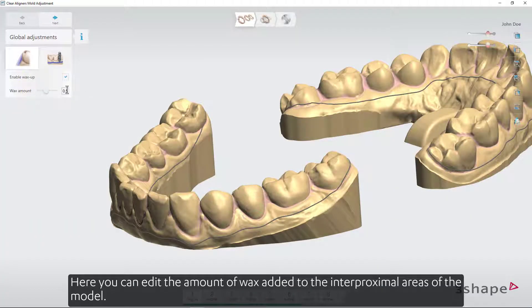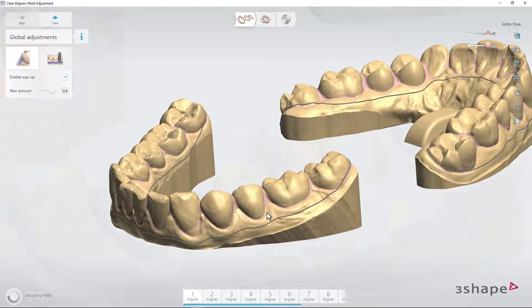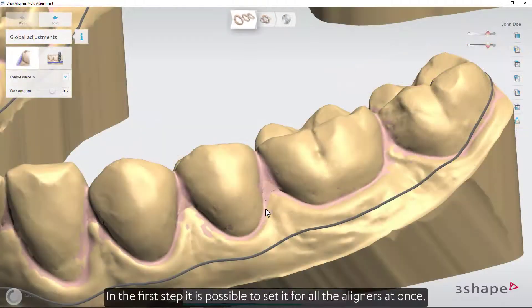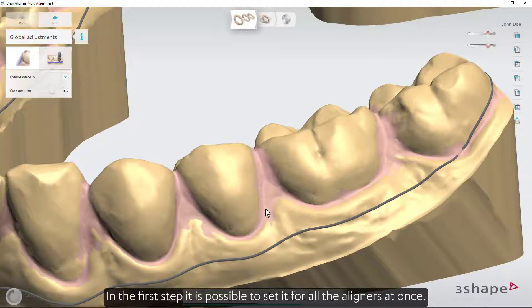Here you can edit the amount of wax added to the interproximal areas of the model. In the first step, it's possible to set it for all the aligners you want.